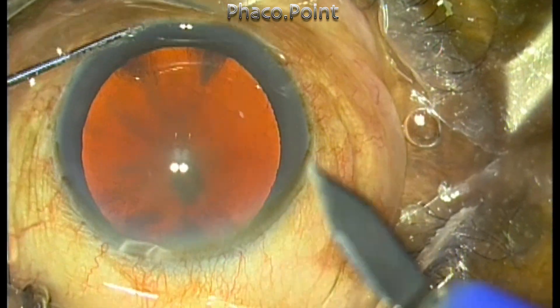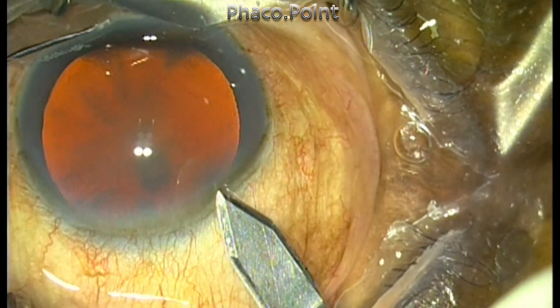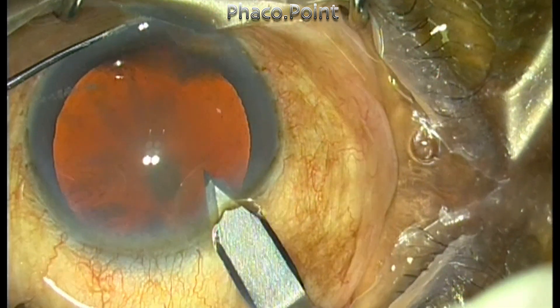This is a patient with an extremely hard, grade 5 to 6 nucleosclerotic cataract, as you can see from the red glow itself.